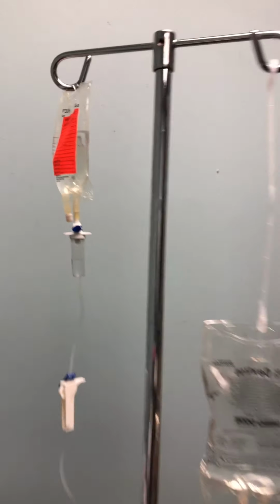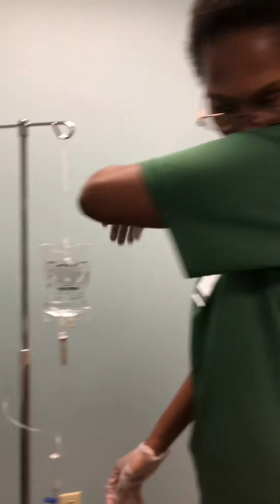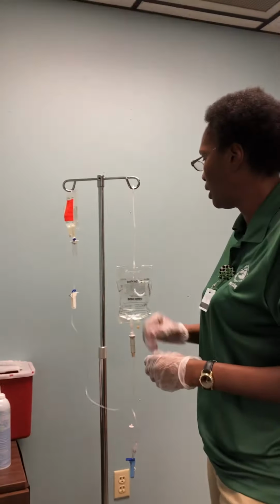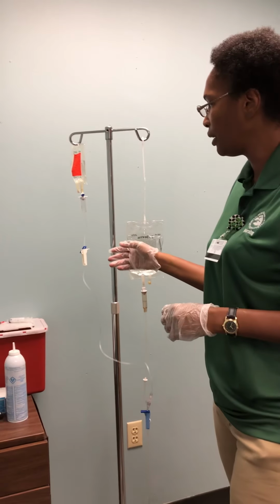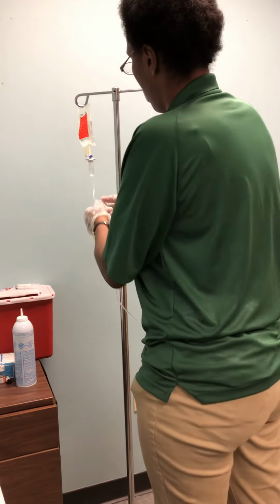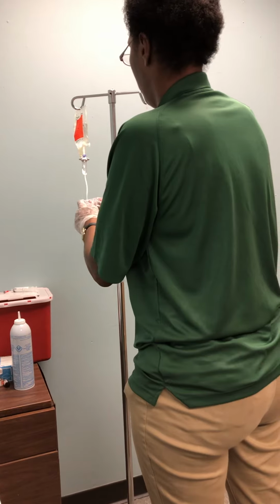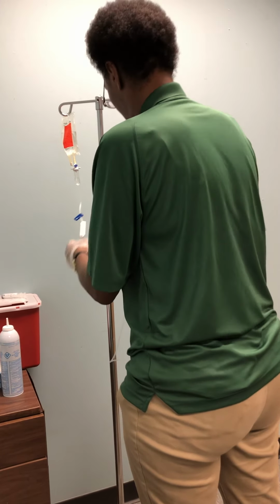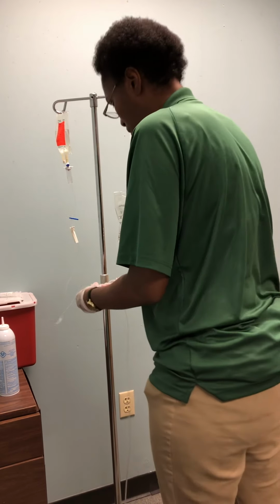Okay, stop. Once the medication is done, I will clamp off my piggyback. Disconnect it.